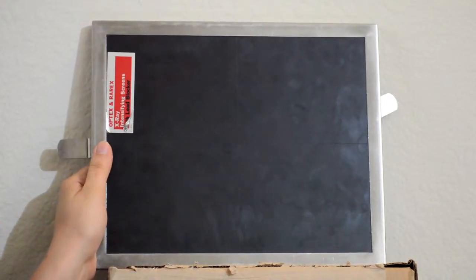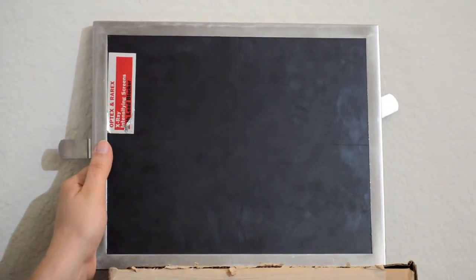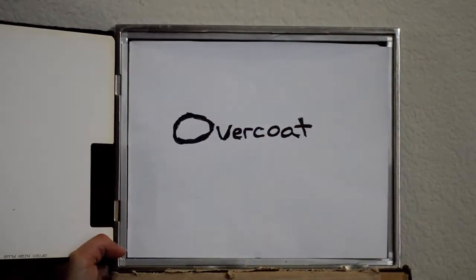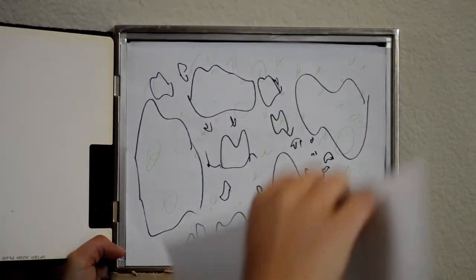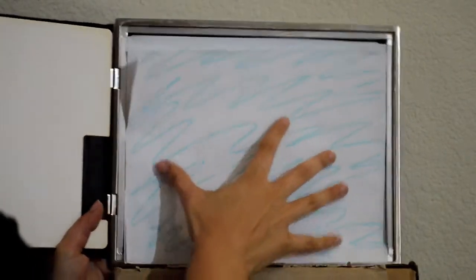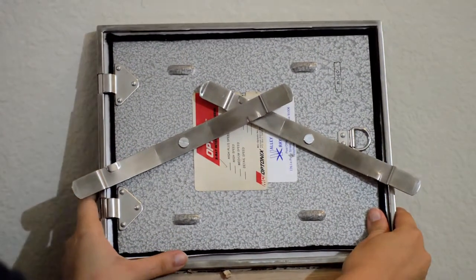So from front to back, you have the cassette, which has a plastic front to allow penetration, and a pressure pad to keep the screen and film in close contact. Then the screen in the cassette has a base layer, a reflective layer, and an active phosphor layer containing the rare earth phosphors. Then the film in contact with the screen has an overcoat, an emulsive active layer, an adhesive, and a blue tinted base. And lastly, the back of the cassette is lead backed to prevent backscatter.